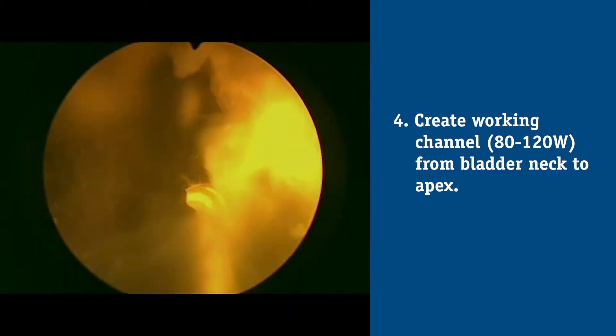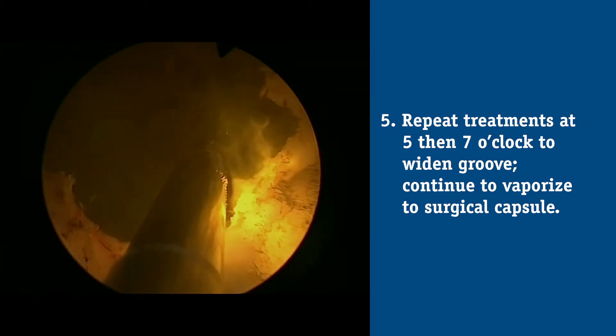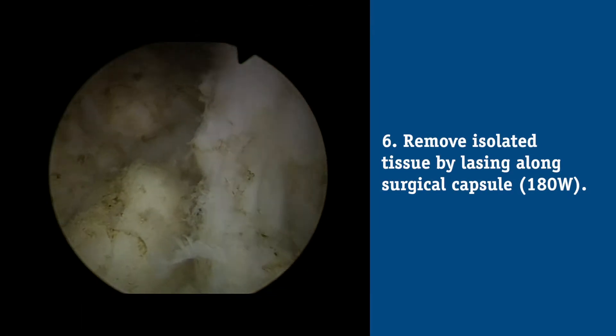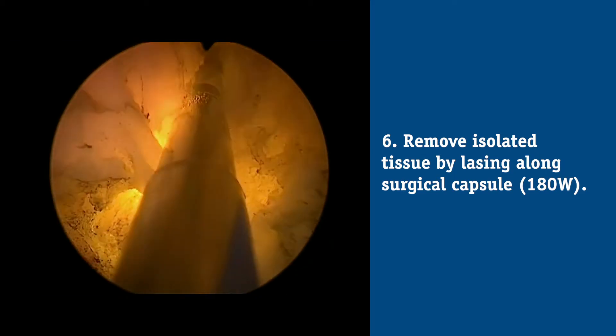That groove is brought out distally to the level of the verumontanum. The next step is to make laser incisions on low energy at 5 o'clock and 7 o'clock down to the level of the bladder neck and the circular fibers. At that point, I drive up the energy from low energy — typically 80 to 120 watts — up to between 150 and 180 watts. At that energy, I systematically vapor resect, nucleate, or vaporize the tissue between those two grooves.